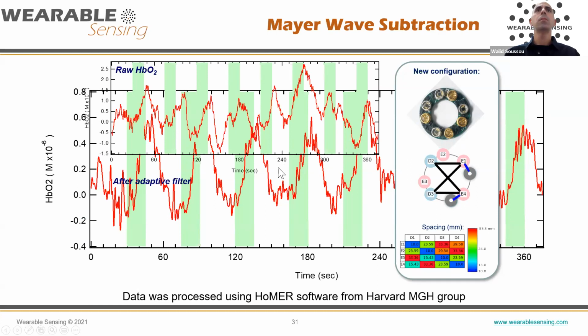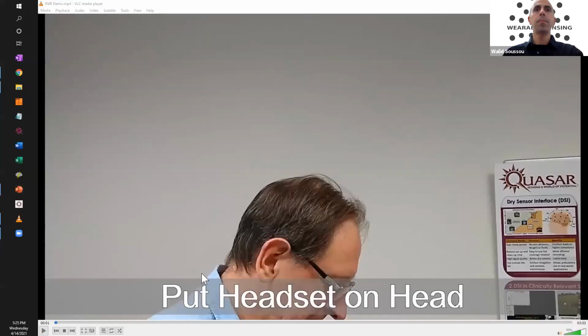Oops, I'm not sure what happened in this figure here. It looks like it blew up on us. So this is the raw tracing on the original one, and you can see that the lines are going quite a bit up and down. And here, once we do the adaptive filter, the scale, sorry, I'm just going to adjust that so that we can see what we're talking about.